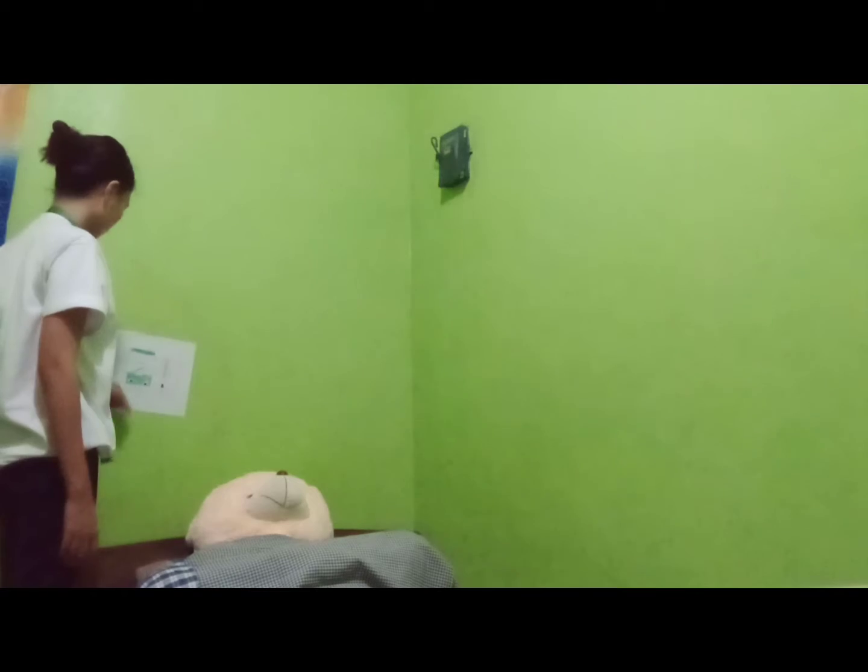Turn on suction device and adjust pressure. Infants and children: 50 to 75 mmHg; adults: 100 to 120 mmHg. Excessive negative pressure traumatizes mucosa and can induce hypoxia.